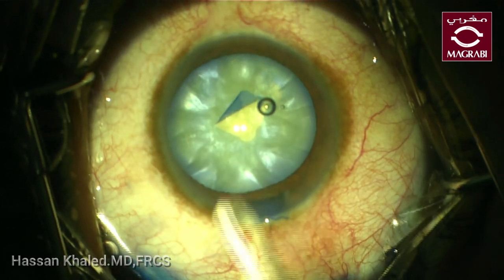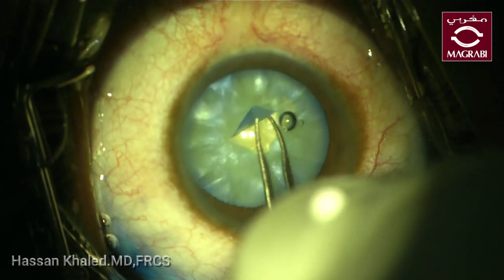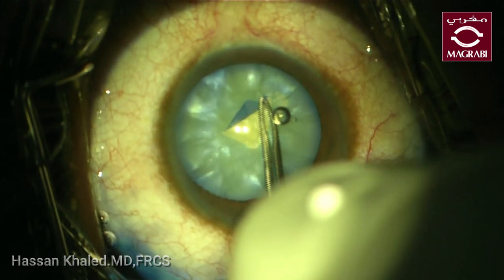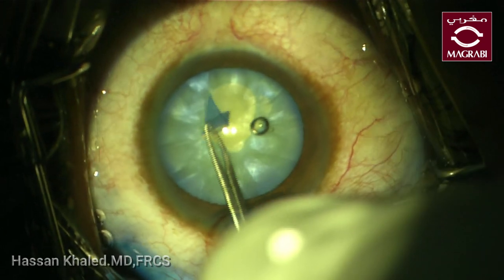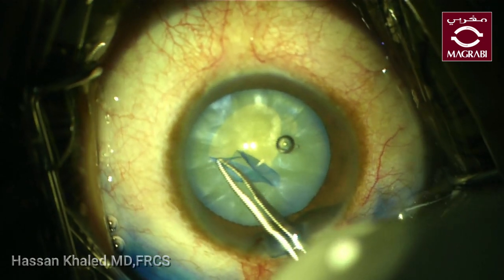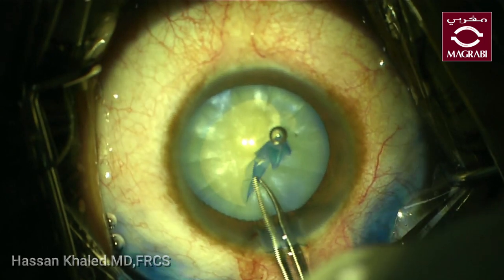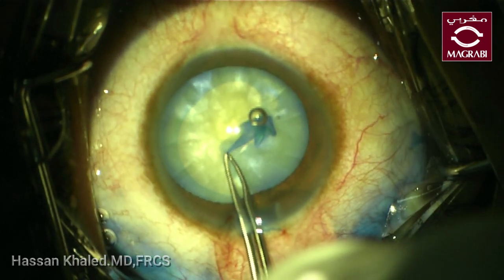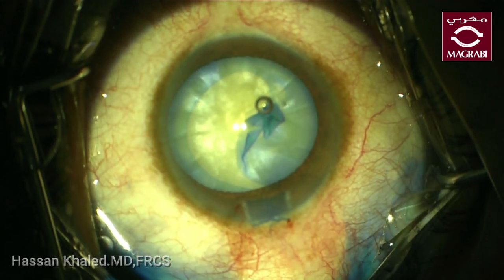After aspirating the milky fluid and depressurizing the intralenticular pressure, I am using the rhexis forceps to complete the anterior capsulorrhexis. You can see the anterior capsulorrhexis here. Look carefully — at eight o'clock, you can see the anterior rhexis has extended to the periphery at this point.